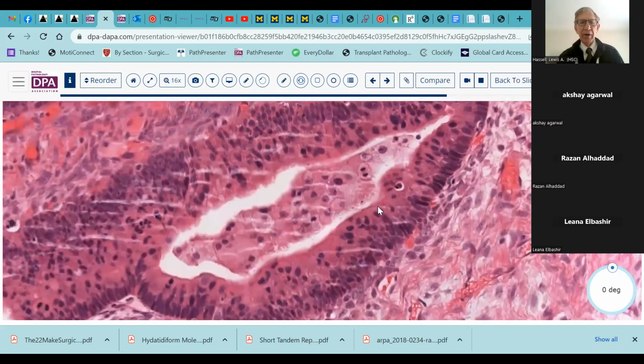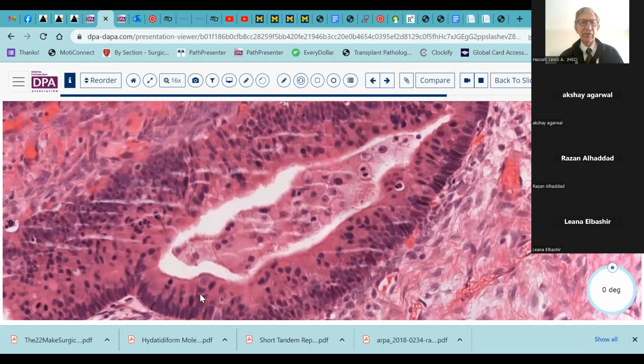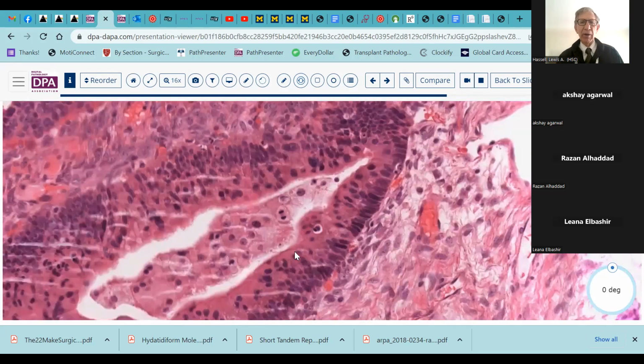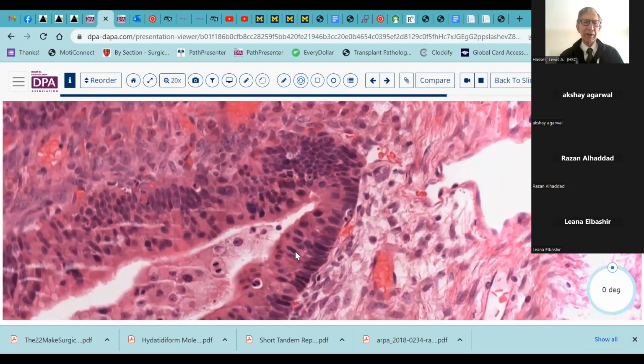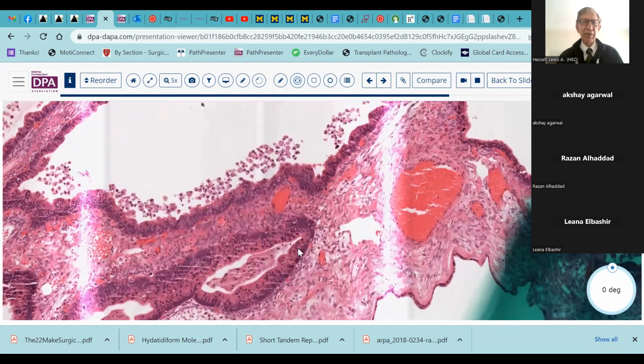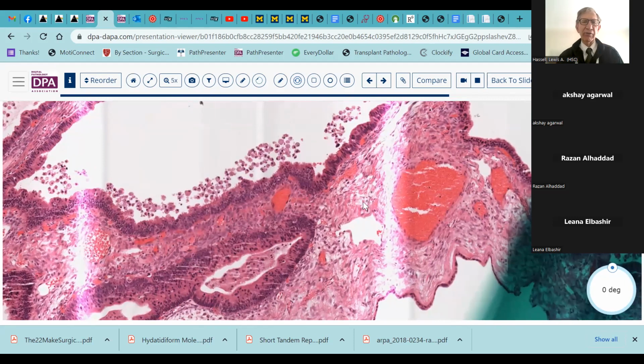Now, why do I say they're endometrioid? Well, a couple of things. One is they're tall cells. You have some degree of proliferative activity, which would raise concern for possible endometrial proliferative disease like hyperplasia or even neoplasia. And you have the characteristic endometrioid type stroma.